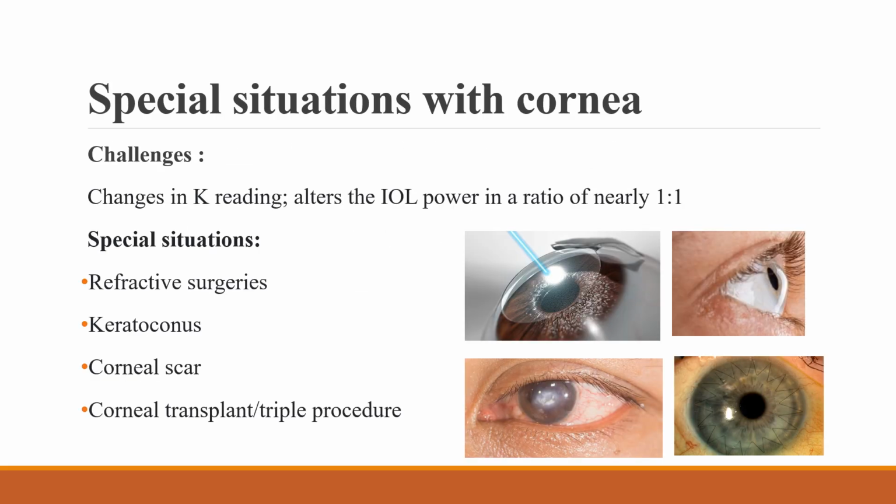Now we can discuss special situations with cornea. Challenges are changes in K reading alters the IOL power in a ratio of nearly 1:1. The special situations are refractive surgeries, keratoconus, corneal scar, corneal transplant, or triple procedure.